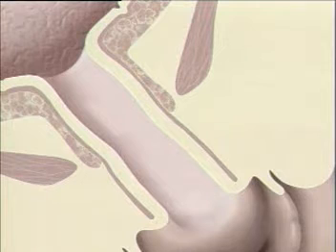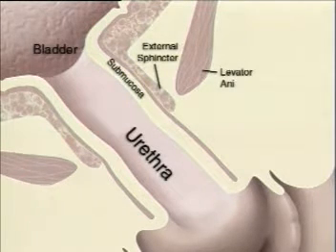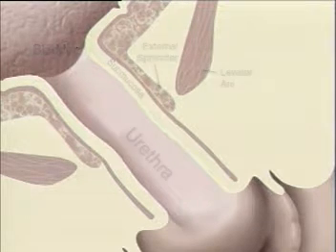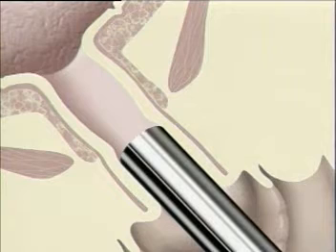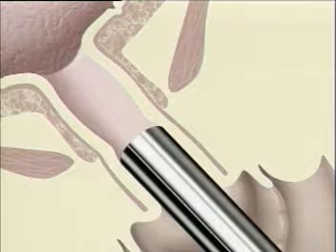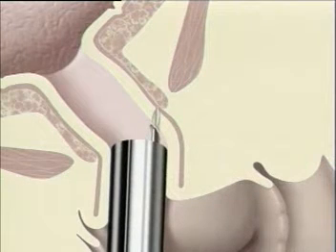The objective of the procedure is to obtain closure from the bladder neck to mid-urethra by injecting Durasphere until the tissue surrounding the bladder neck coapts. Insert the primed needle into the scope and insert the scope into the urethra. At mid-urethra, choose a position that is comfortable, between 4 and 8 o'clock.